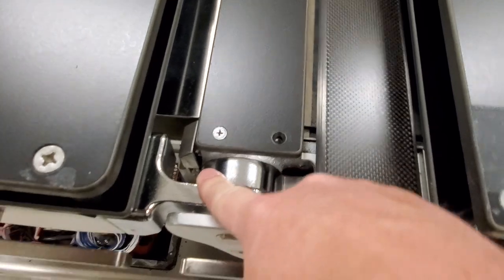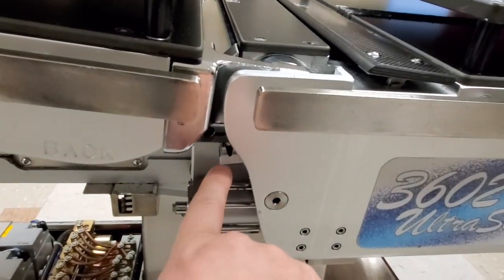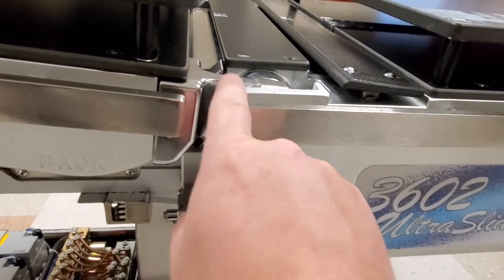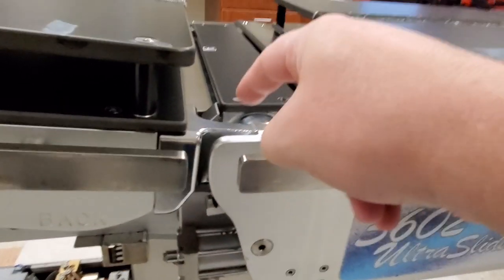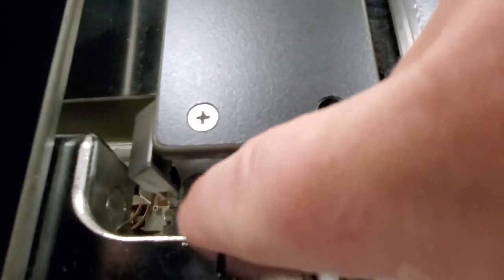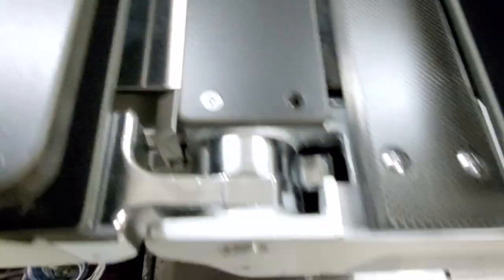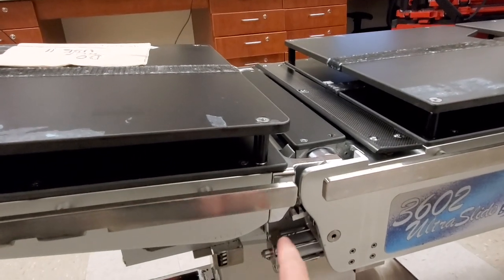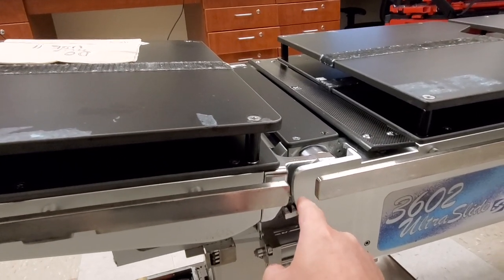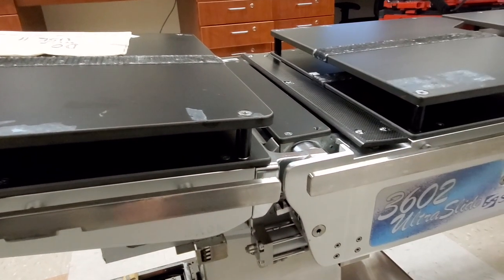What it would do is the back would raise up to a certain percentage and then it would activate these little micro switches. As this section rotates, there is a rack and pinion right here, and it comes up and hits this micro switch — you can see the roller head of it right there. It hits that micro switch and says it's at its physical limitation.